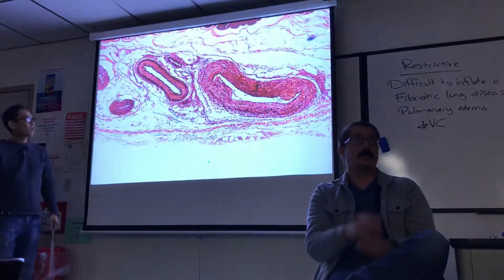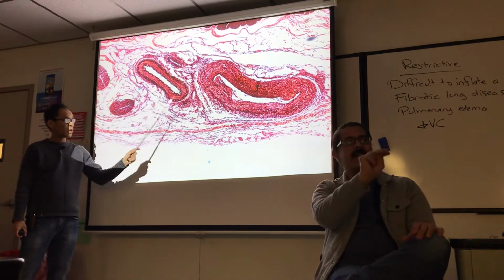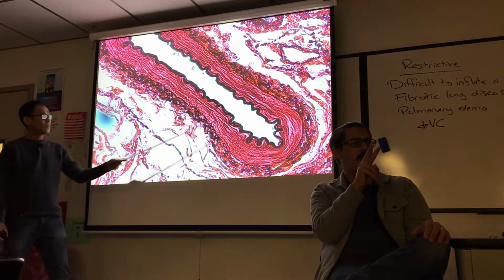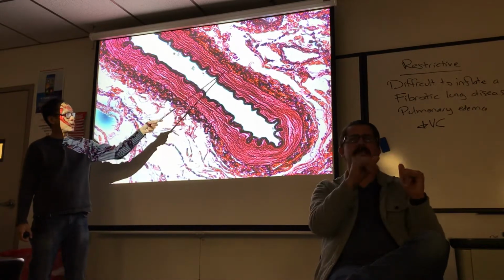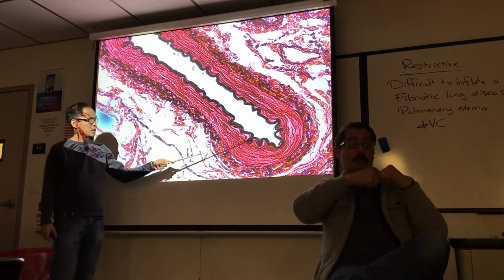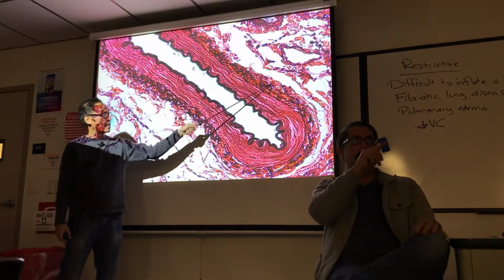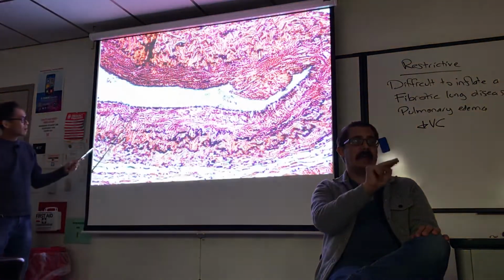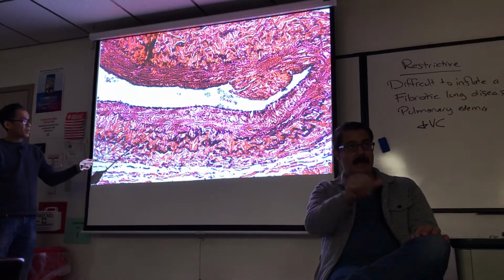The smaller arteries are the muscular arteries shown here, and that's a large vein. Muscular artery, large vein. If we take a look at the artery closer, you can see that the muscular artery in the TM has a higher content of smooth muscle, but I still see blackish lines which indicate elastic fibers. Now this dark structure in tunica intima is the internal elastic lamina. So that's the TI, TM, that's TA, that's tunica adventitia.